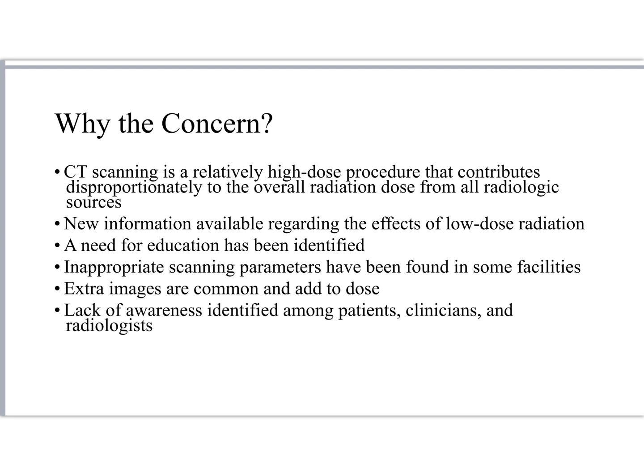And bear in mind, we are the only industry in the United States of America that is allowed to knowingly and intentionally expose U.S. citizens to radiation. Nuclear power can't do that. There's a lot of people who use radiation, and they cannot intentionally expose people to radiation. So this is not a small thing that we're allowed to do this as medical professionals.